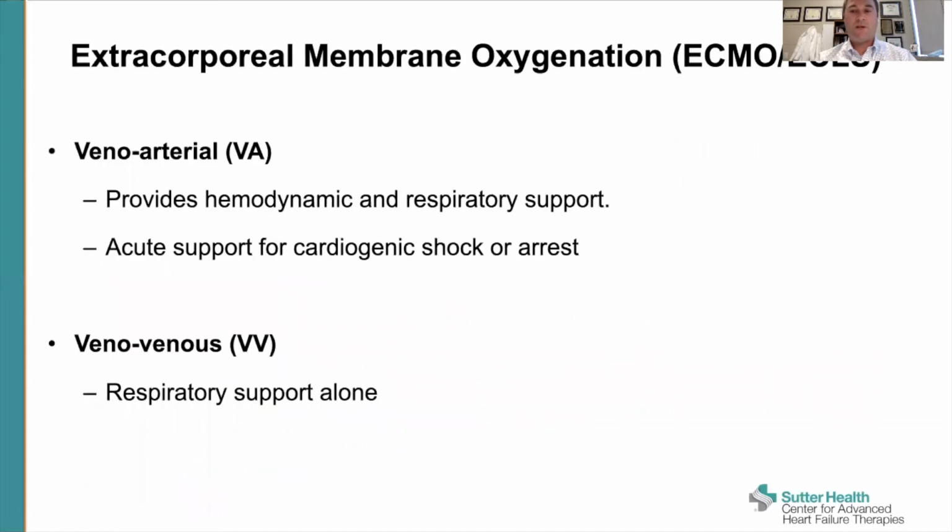Now moving on to ECMO, which is a device that's becoming increasingly utilized across the country, and so it's important to be familiar with some of the things related to this. However, you could spend several lectures just talking about ECMO alone, so we're just going to give you some basics today. There are two different kinds of ECMO, Veno-Arterial and Veno-Venous, and we're really only going to talk about Veno-Arterial ECMO today. VA ECMO provides hemodynamic and respiratory support, and it is the most useful tool for acute support for cardiogenic shock or post-arrest, whereas VV ECMO, or Veno-Venous, is used primarily for pure respiratory failure and does not provide cardiac support.